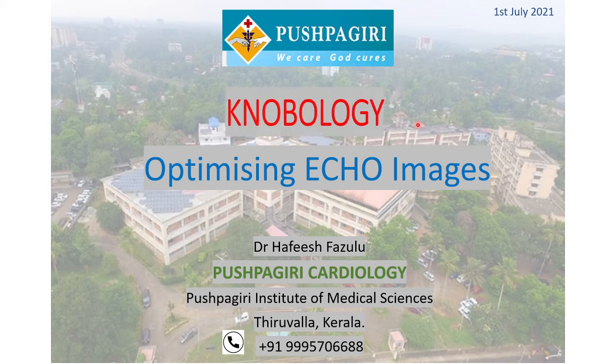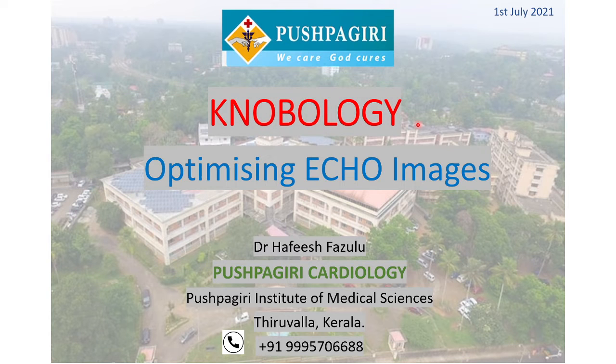The topic of the day is Knobology. I'll be talking about how you can optimize all the settings on an echo machine so that you get the best possible image without any noise, without getting the artifacts, etc.